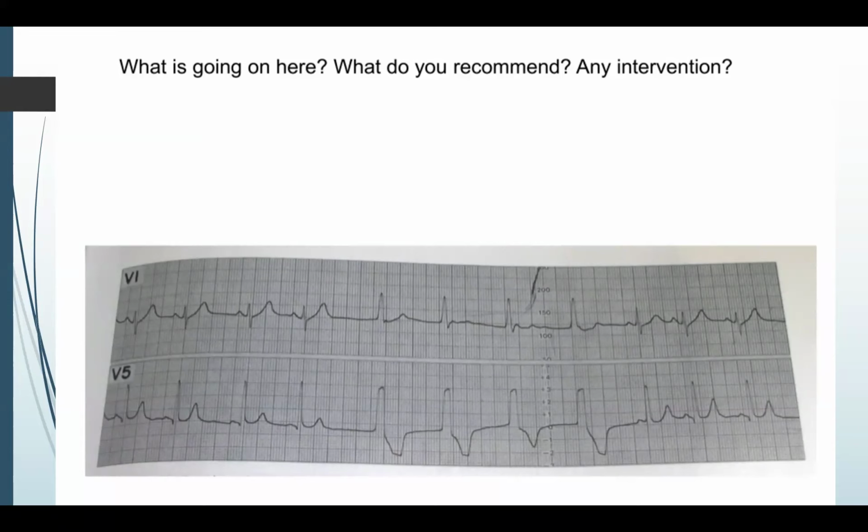Sometimes cardiologists will ask me, do they need to repeat this? I might do it one more time at some later date just to confirm that the sinus node is okay. Another way of inferring that the sinus node is okay is just looking at what the sinus rates are over the heart rate trend. If when this patient is awake, they have normal heart rate variability, that their heart rate goes up very high when they're exercising or have a higher adrenergic tone, I would be much less concerned. So could this be a sign of sinus node dysfunction? Maybe, I don't know, but this is not an especially worrisome finding. So I think anything from doing nothing to surveilling it a little bit more are both reasonable options depending on your level of concern and anxiety as the doctor.